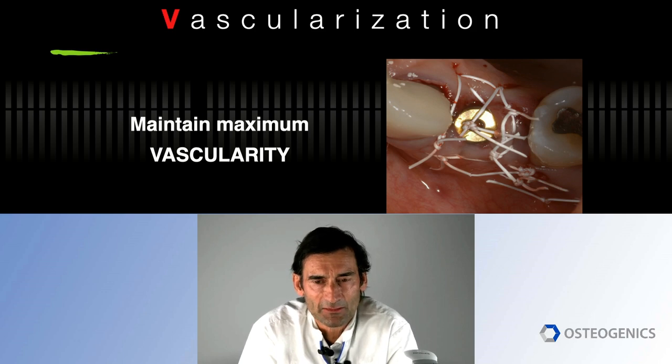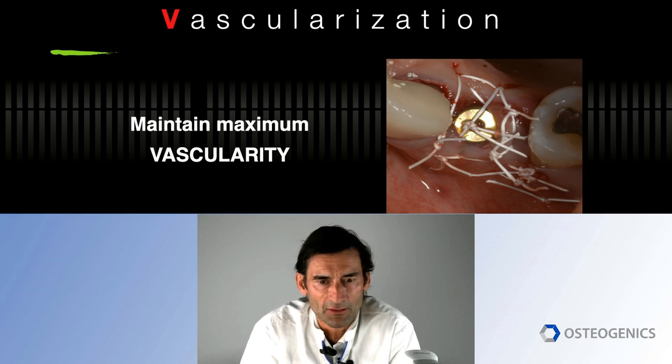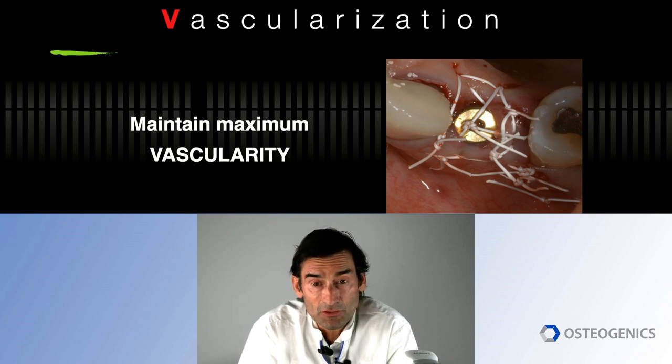This particular slide was more of a fun slide, because many people sometimes over suture a site. So always maintain the health of the flap and maintain maximum vascularity. Utilize the proper needle, a small needle, and the proper suture material, so there is minimal inflammation. And of course, use a technique with minimal tension. Always think about vascularity in your flap.